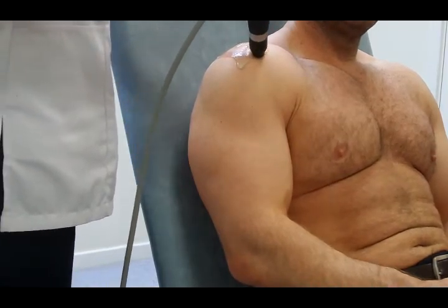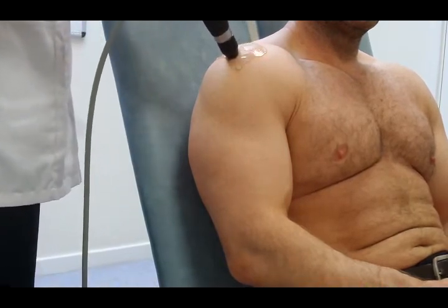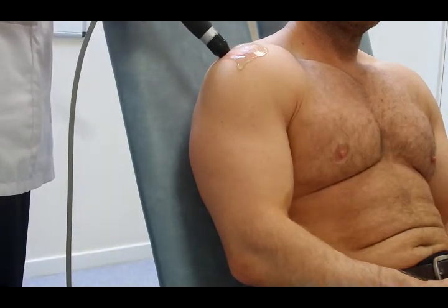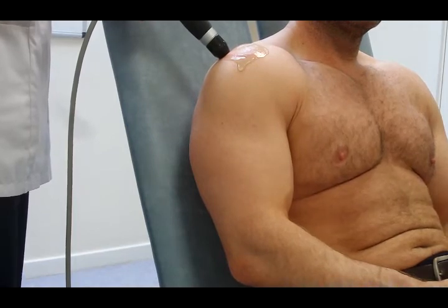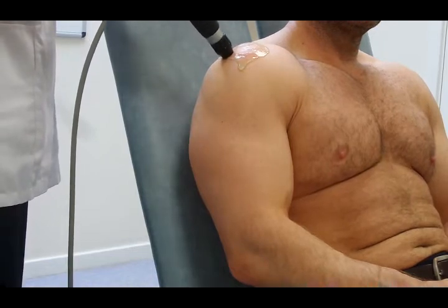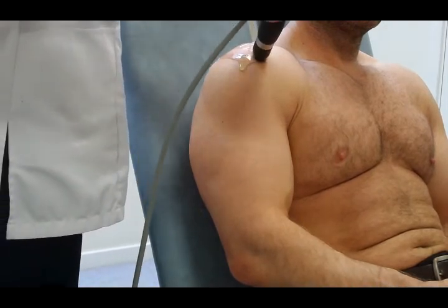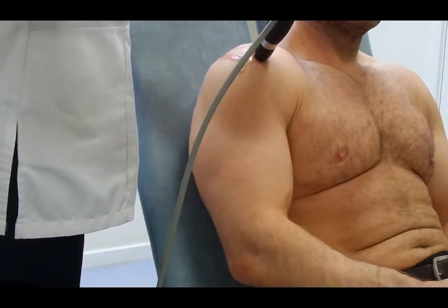It's not unusual to stop on those areas and deliver about 200 shocks. To deliver enough shocks to produce cavitation on a single area, you'd really be looking at about 500 to 600 shocks, so we're not trying to create too much cavitation into the shoulder. Continue working backwards and forwards around the shoulder and around the supraspinatus tendon, loitering on an area for a couple of 200 shocks.